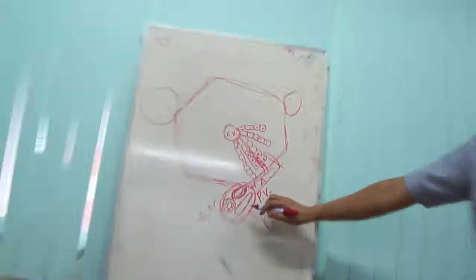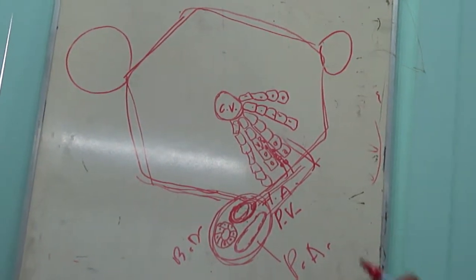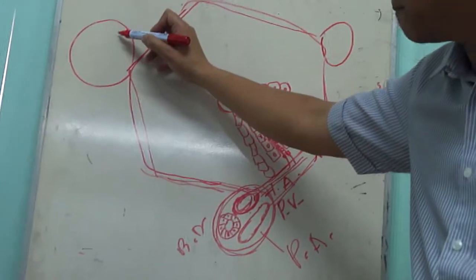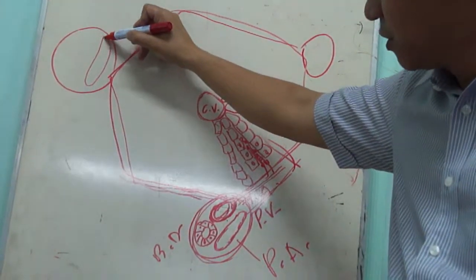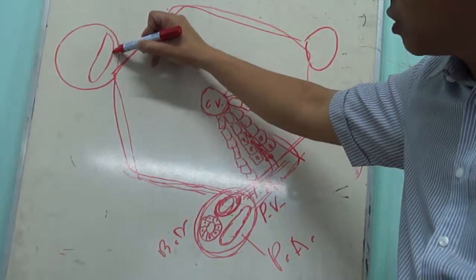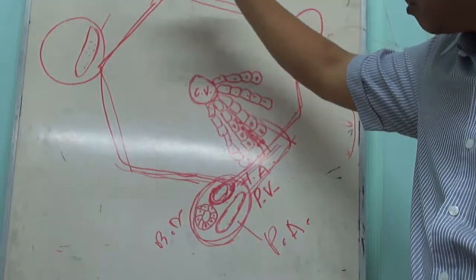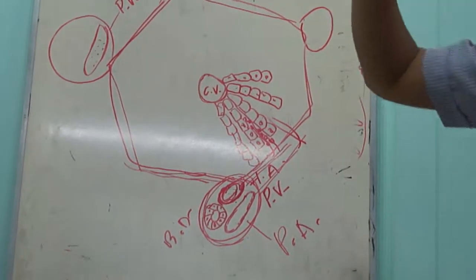And then at the periphery of the lobule, we will be able to see three areas which will contain these three structures. How do you call these areas? The portal areas, containing the portal triad. So, contained in the portal triad, very prominent, you should be able to identify this structure first, which will show us a large lumen with very thin wall and containing blood vessels. This structure is called the branch of the portal vein.